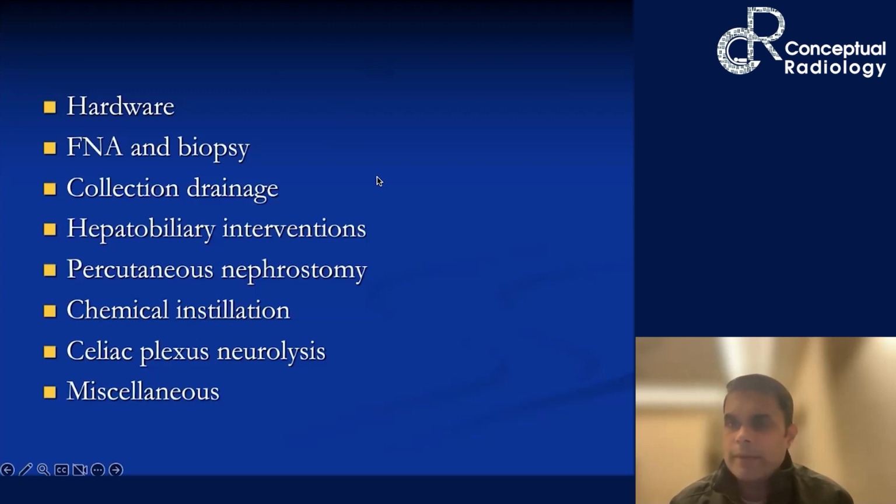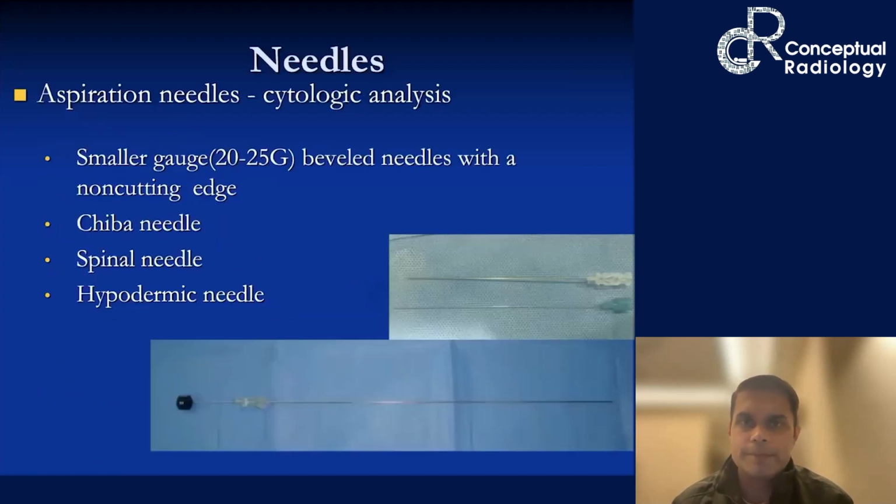So the hardware we'll be discussing today is primarily the needles for FNAC and the biopsy gun, and FNAC and biopsy will be covered in today's lecture. We have other non-vascular interventions which we plan to discuss later on, but the primary idea will be to tell you each and everything that you need to do for FNA and biopsy.